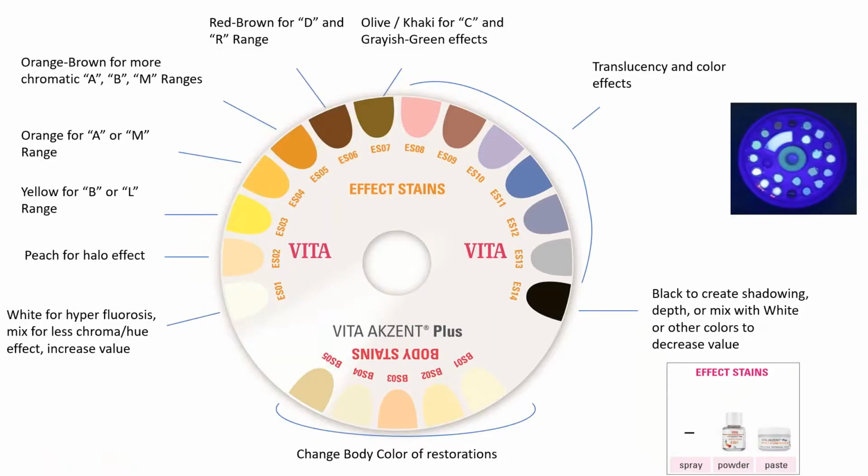So when we start talking about external, we're talking stain and glaze. And I'm sure all of you are technicians and have done stain and glaze before, but you know that for the most part, stain and glaze is kind of a visual trick, if you will, where all of the color is simply at the surface. So we're not getting it from the inside, but we adjust it on the outside.